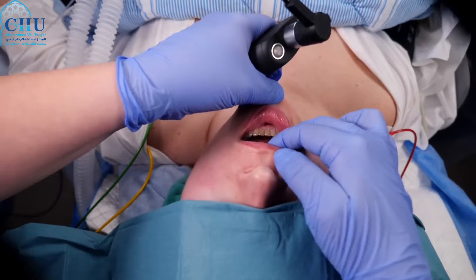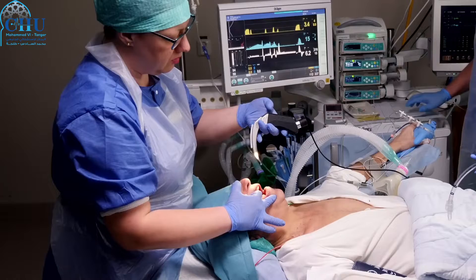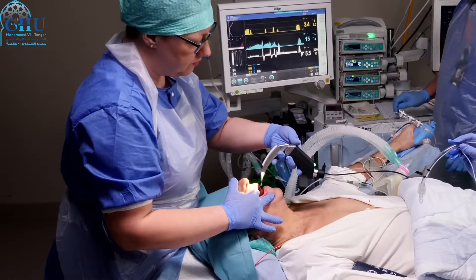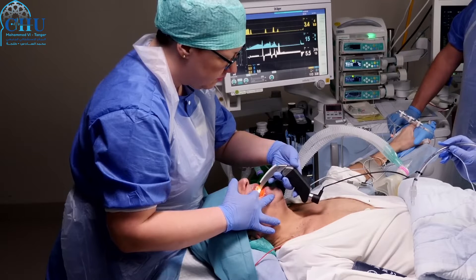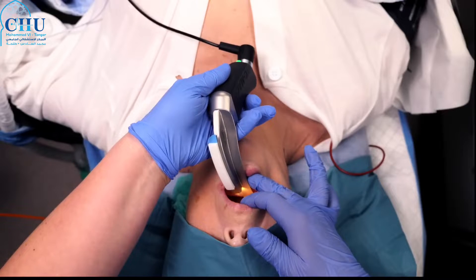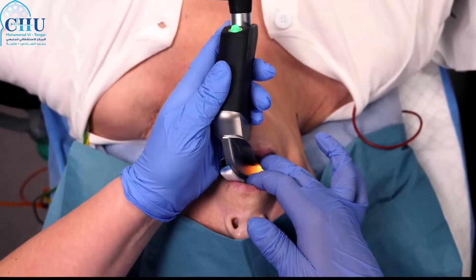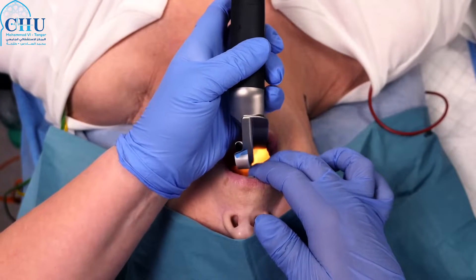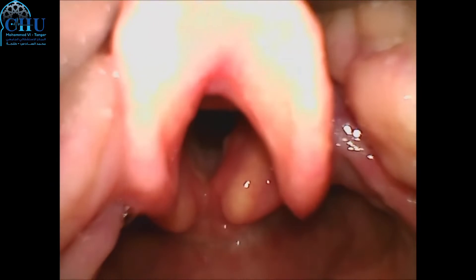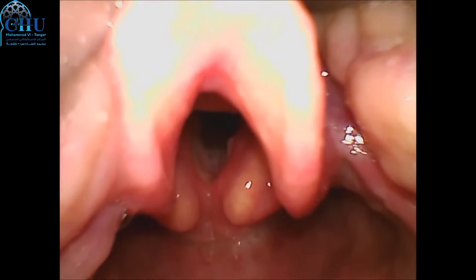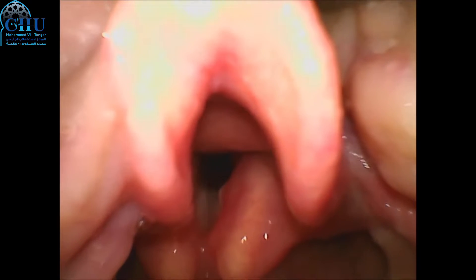Open the patient's mouth with your right hand and hold the laryngoscope in your left — not too tight, with three or four fingers as close to the blade as possible for precision and control. Insert the blade in the right side of the mouth, carefully pushing the tongue aside. The aim is to create an unobstructed line of sight to the larynx by pushing the tongue to the left and lifting the epiglottis, exposing the vocal cords. This requires precision, not brute force.